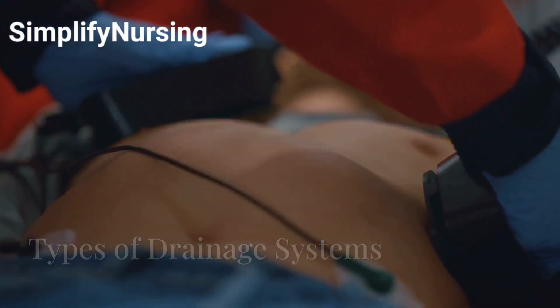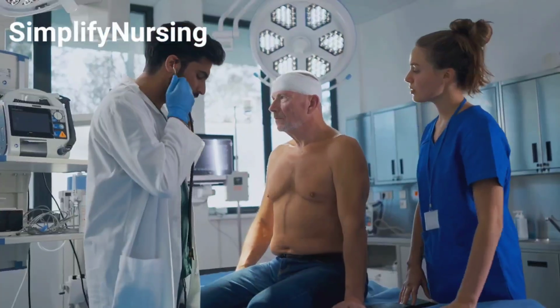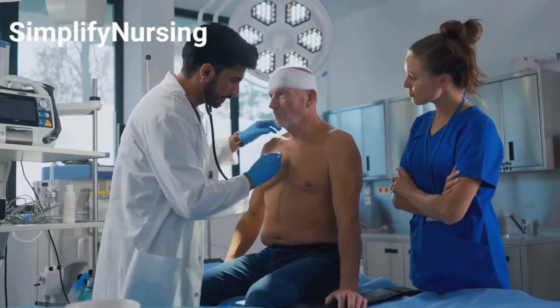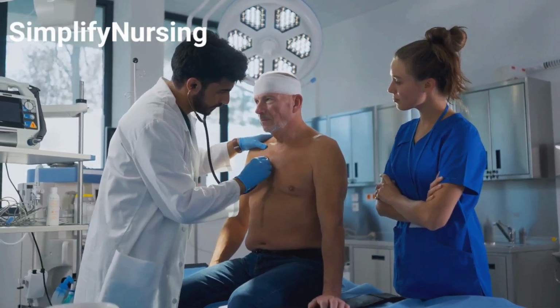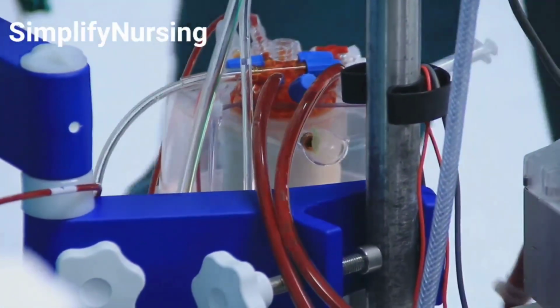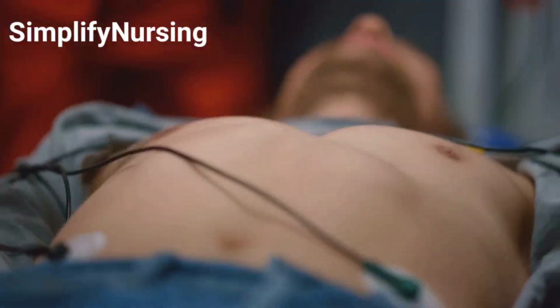Now let's discuss the types of drainage systems. The water seal drainage system utilizes water to create a one-way valve, allowing air or fluid to escape without returning. On the other hand, the dry suction drainage system uses a mechanical valve rather than water to prevent backflow, which allows for easier transport and management.